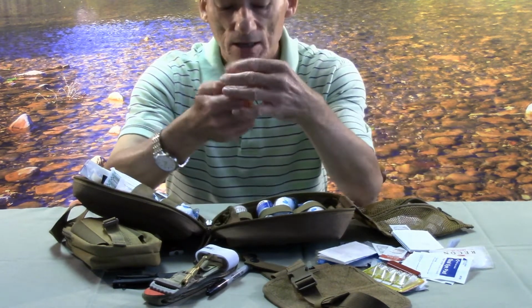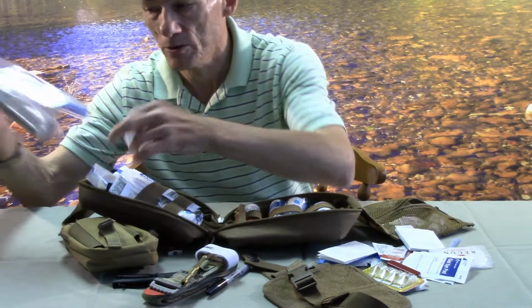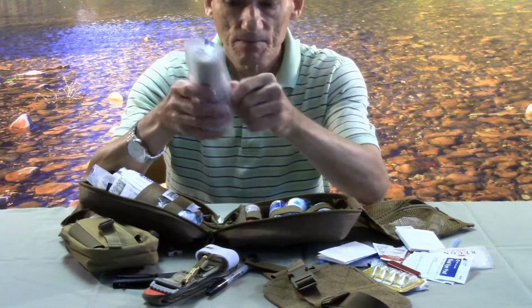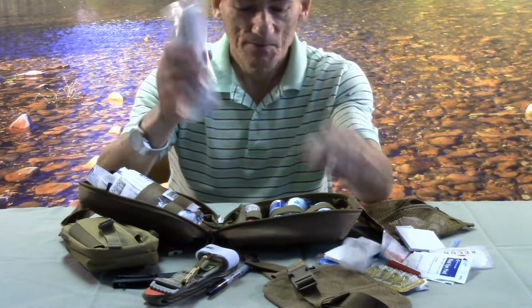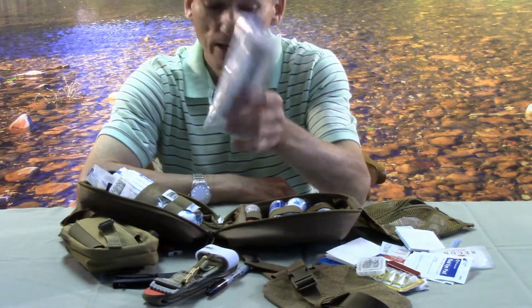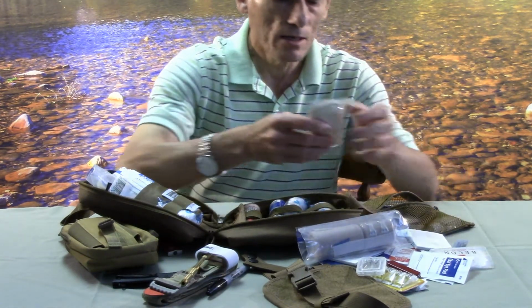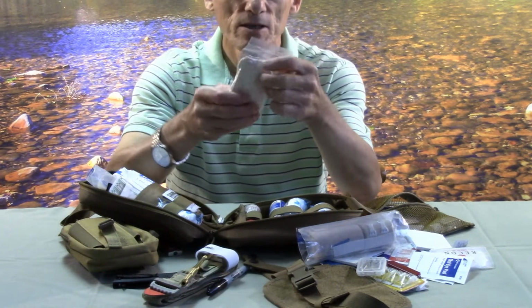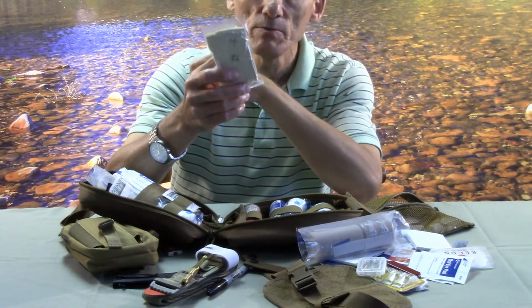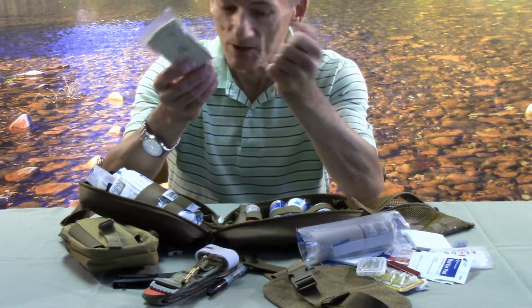Threw those in there, and you would use those for your ace bandages, for instance, if you need extra ones. Basically, that's what that's for. And good time to mention ace bandages. Obviously, always want to carry some of those. They got multiple purposes. And these are your compressed gauze here. Now this little compressed gauze came with that kit that I mentioned. Also has some safety pins in there, but there's only 2. You never know, you may need more.